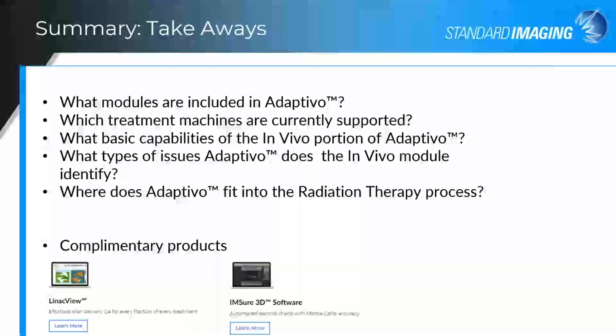And a lot of our customers have found that when they initially install the software, their patient alignments become something for certain case types that they discover things that they hadn't noticed before. And the software has actually helped them zero in on some clinical protocols or set up protocols to maybe make those a little more robust, or it potentially identified an issue with planning that they changed some of their steps.